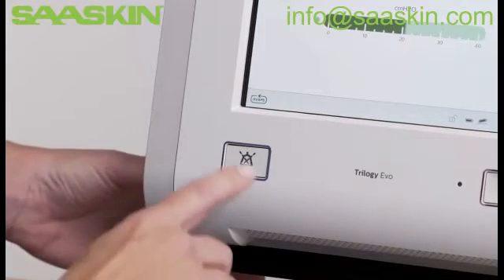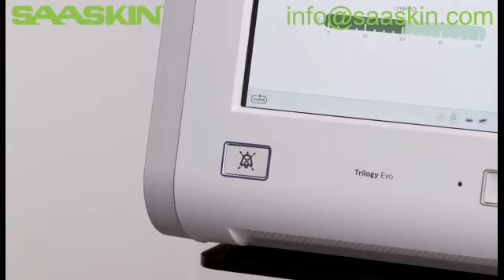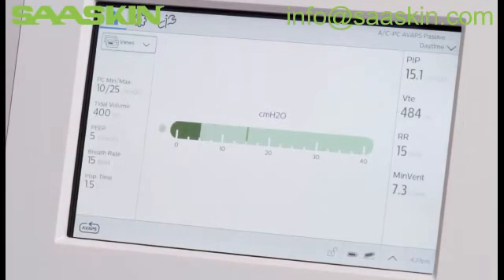There is also an alarm silence button to mute audible alarms for two minutes. A variety of monitoring views are available. Some offer more details than others, depending on whether you are in full or limited access.